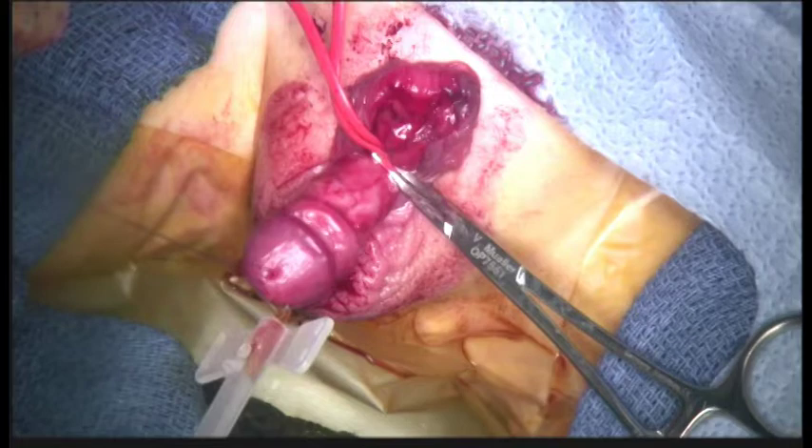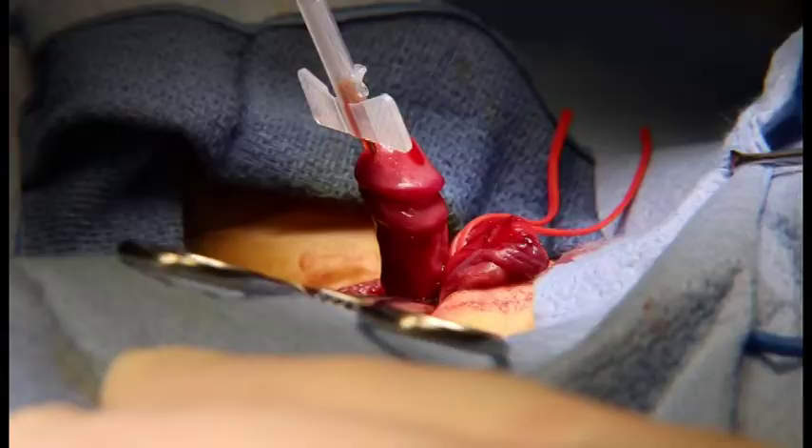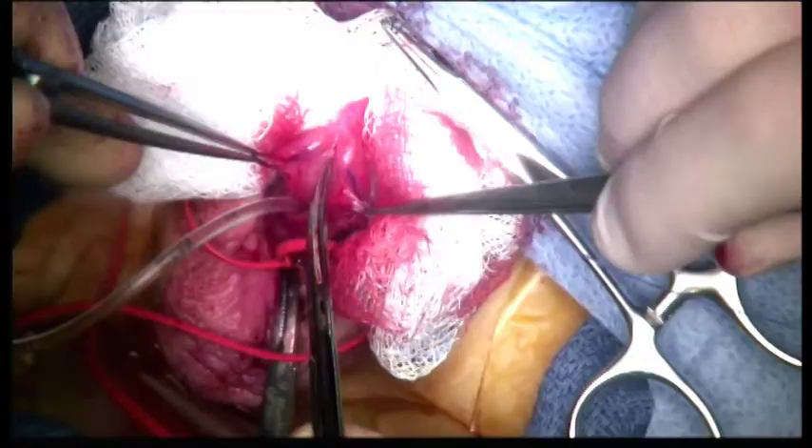Artificial erection can then be performed to determine if there is residual chordee that may need further correction. This is done by placing a tourniquet at the base of the penis and then injecting the corpora with sterile injectable saline. In this patient, complete foreskin dissection led to the chordee being corrected and no further correction was required.